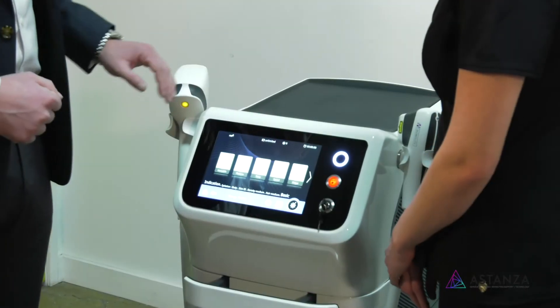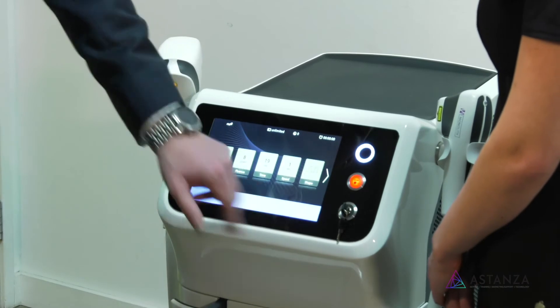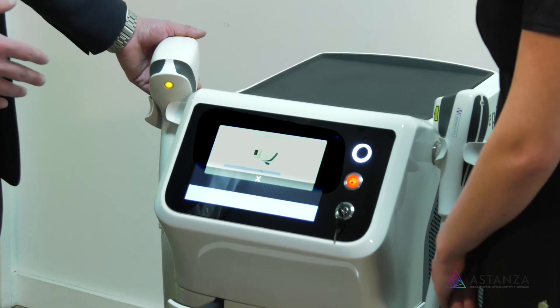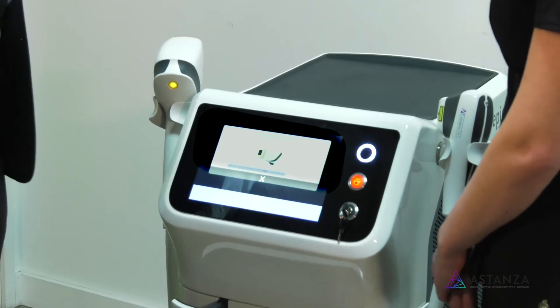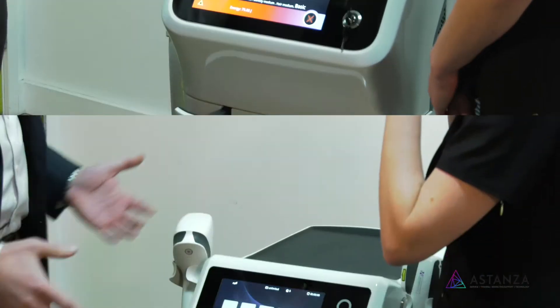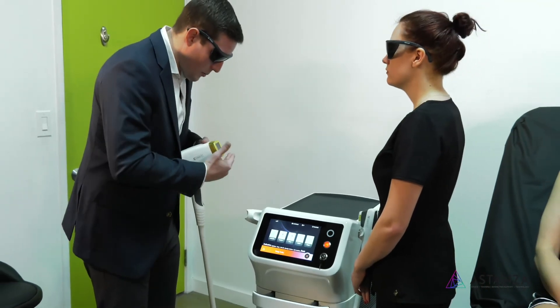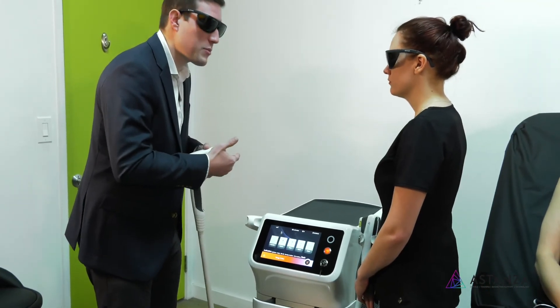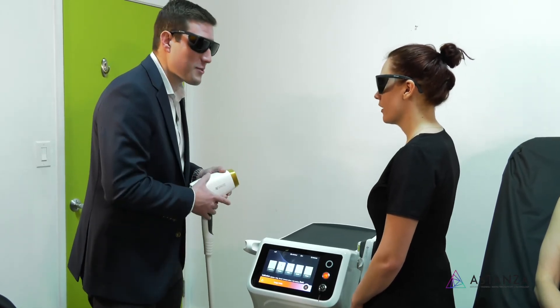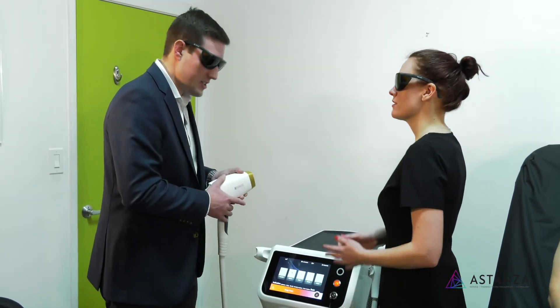What you're hearing right now is the cooling starting up so we'll be ready to rock and roll. This will cool down to the specific temperature you're looking for and then you'll be ready to treat. So now we're ready. Everybody would have their goggles on. When you're treating, remember that the front part of the head is cooling — so if you're pulling down, you want about a 25% overlap, which is pretty common in the industry. Single pass — one single pass. We're in static mode.